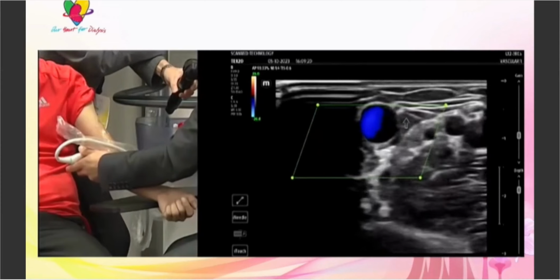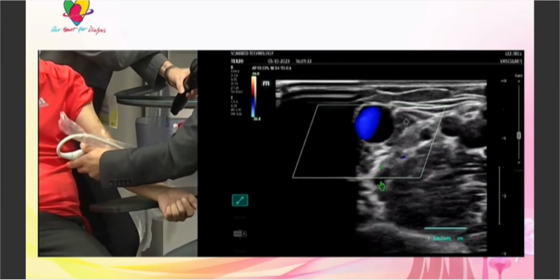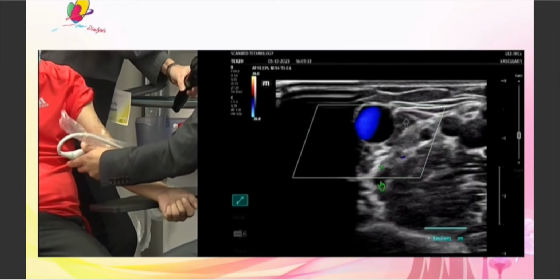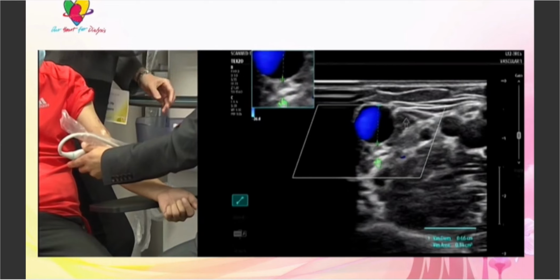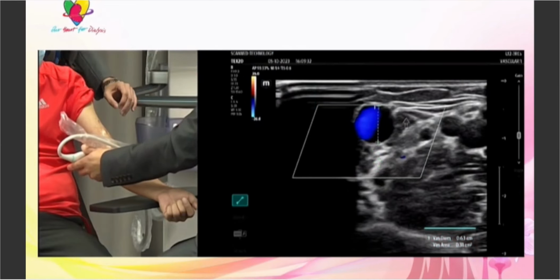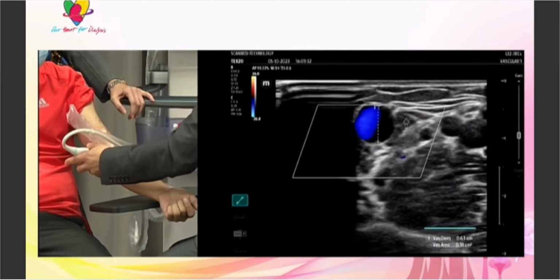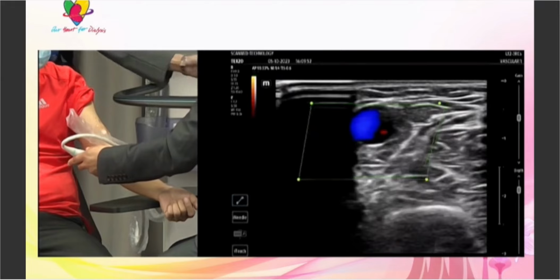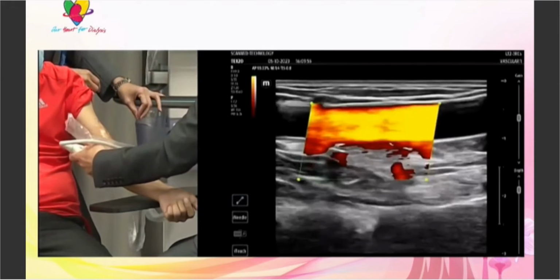So we know, you want to measure? Yeah. Just to see what to expect, because in my experience it is important to do the follow-ups routinely, also if the fistula works, because it can shift from the cephalic towards the basilic. This is 6.3 millimeters, and now we will just do the flow measurement in the basilic vein.